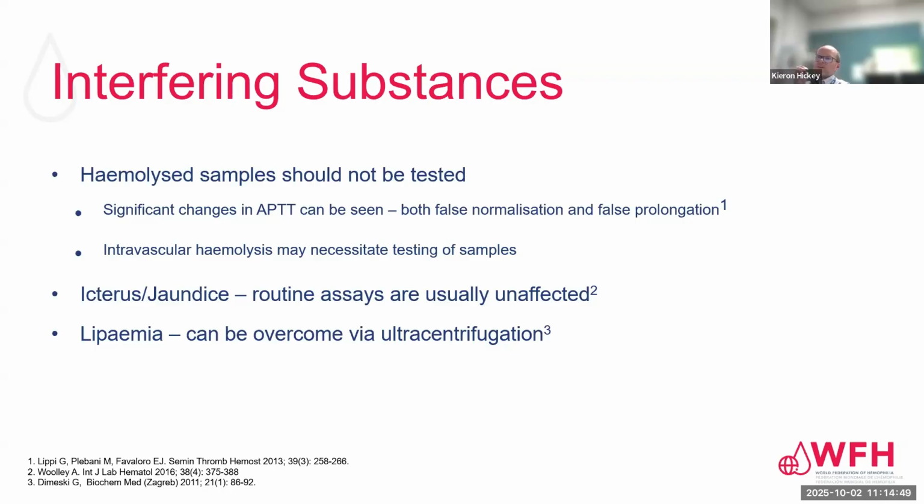It's important to remember that some patients have intravascular hemolysis, and it may necessitate testing samples which are hemolyzed, because you are reflecting the situation inside the patient. Icterus and jaundice, routine assays are usually unaffected by this. And with lipemic samples, which you can sometimes see, this can be overcome by ultracentrifugation.